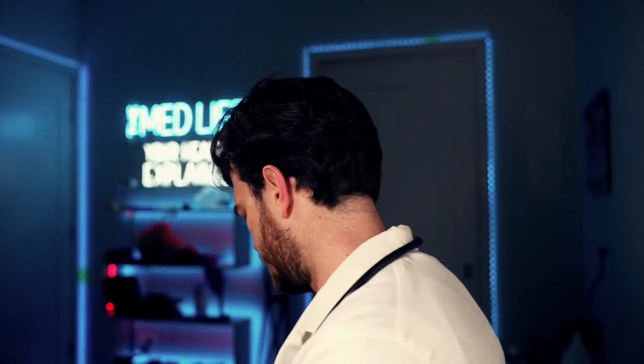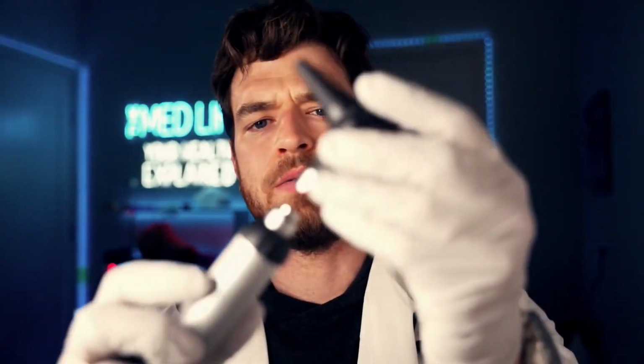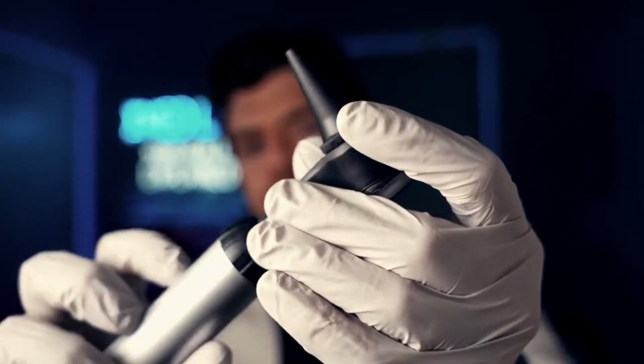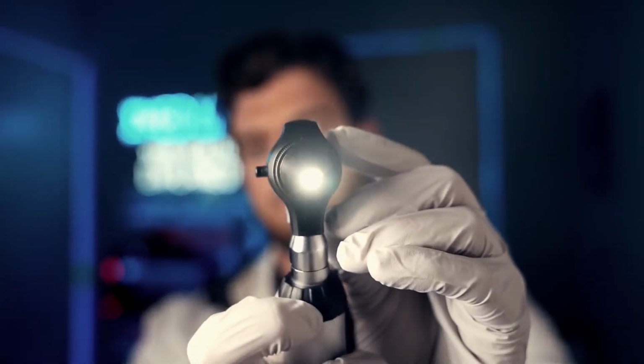I want to look in your ears, nose, mouth to make sure I'm not missing something. Okay? Great. We'll get our kit ready, which has our otoscope right here. And this will allow us to take a look in your ears, which is where I'll start, if that's okay with you. Great. You just relax and look straight ahead.